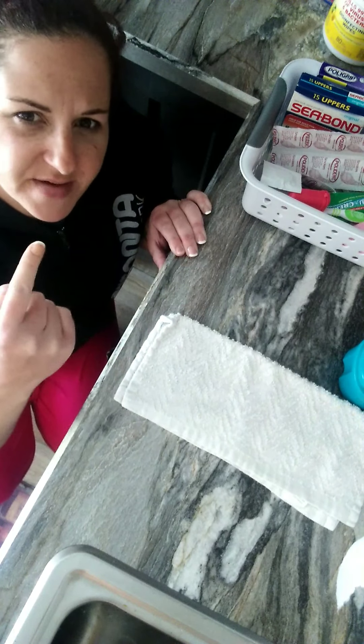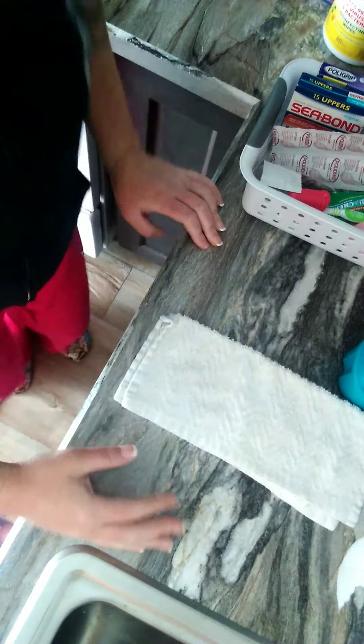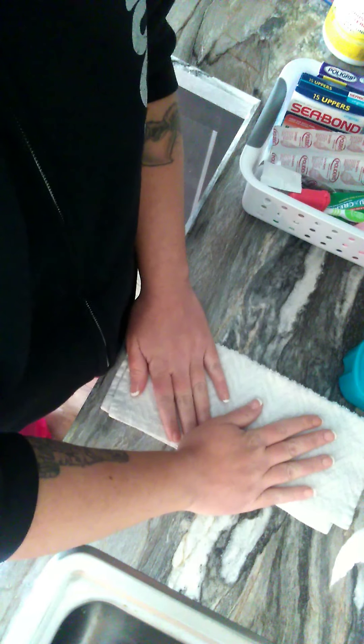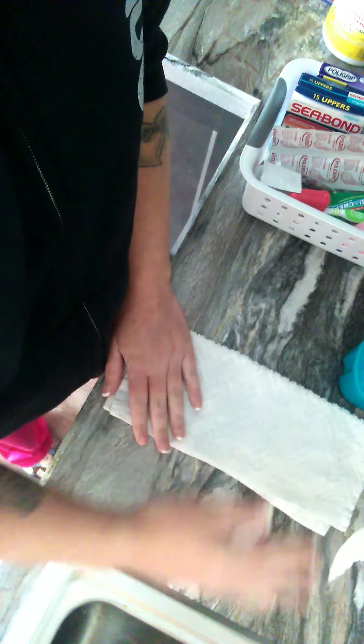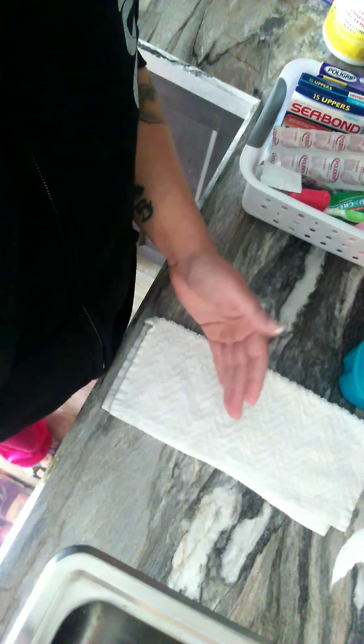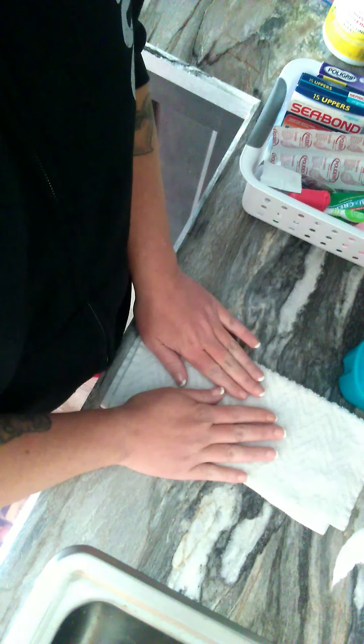My steps are putting them in my face. I have my camera a really weird way so you can actually see what I'm doing. I have a washcloth, so I use everything over this. The reason why is because I don't want to drop my dentures in the sink because water or not, you can still break them. So I do everything over here.